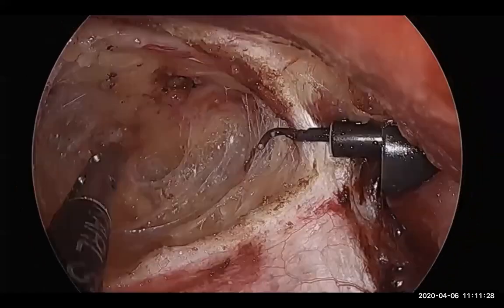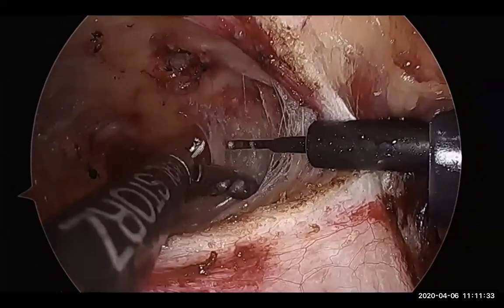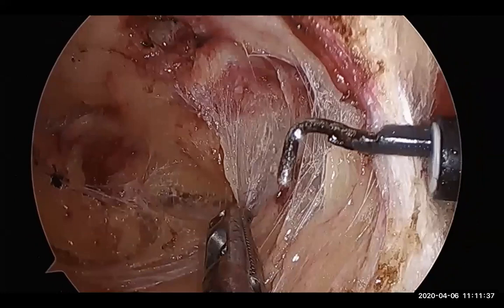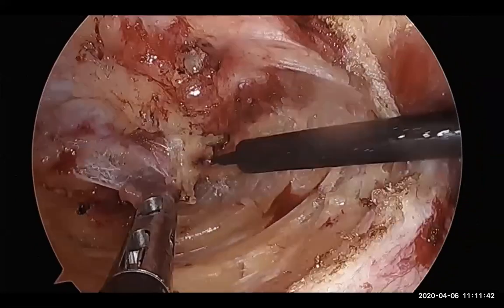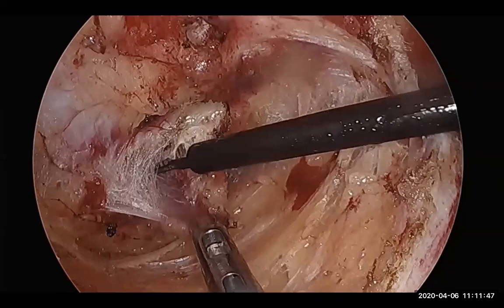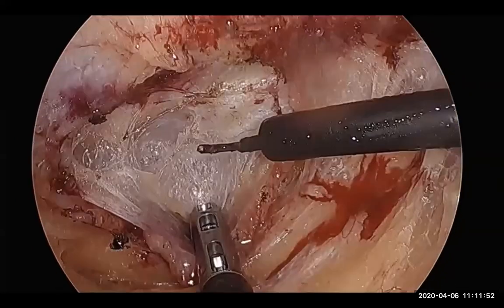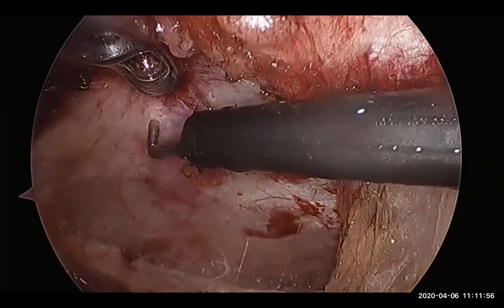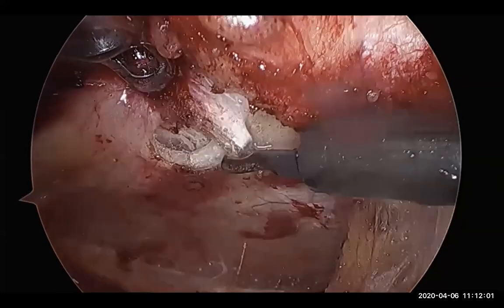So this is the upper crossover, and you can see we are dividing the posterior rectus sheath of the patient's left side, and the yellow fat is the falciform ligament fat, which has been pushed down, and we are now trying to expose the undersurface of the PRS of the right side. Once you expose the PRS of the right side, make sure to incise at the right place where the muscle is there. Don't incise the linea alba, as that will be an iatrogenic injury leading to an incisional hernia recurrence there.